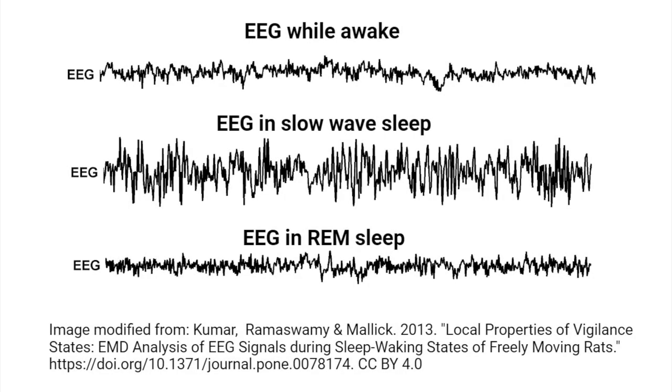While studies of event-related potentials, or ERPs, focus on sudden, rapid changes in EEG recordings after specific tasks, sleep researchers are more interested in how EEG brainwaves vary over longer time courses.